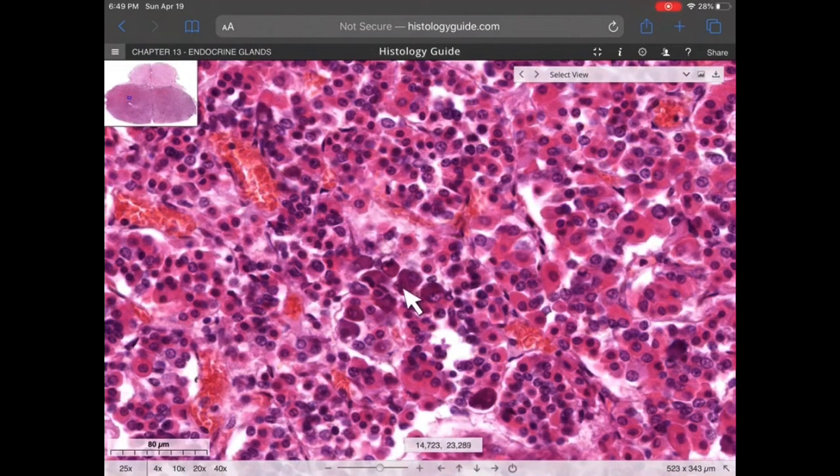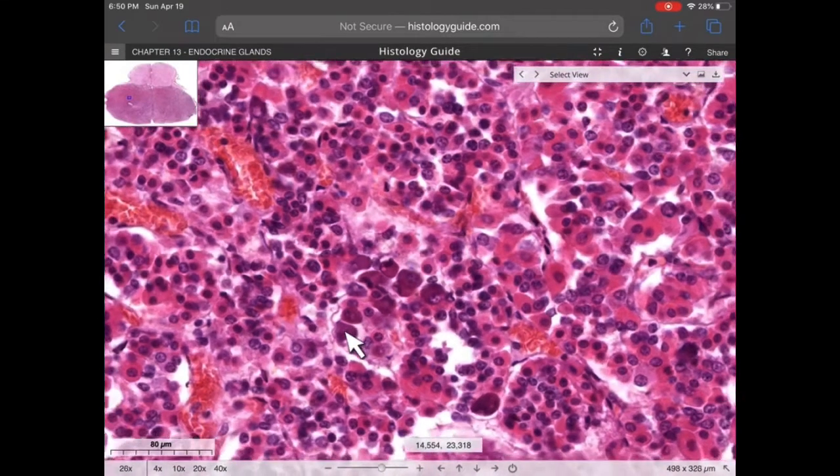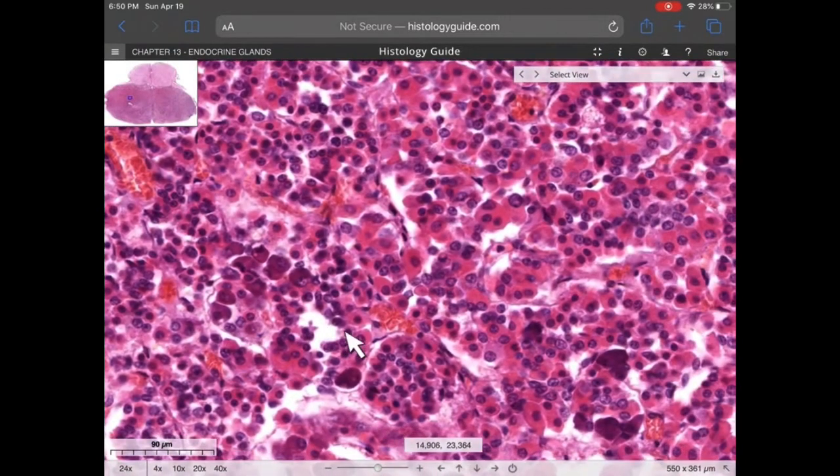So the reason that the pars distalis looks so much more vibrant compared with the pars intermedia or pars nervosa is primarily because of what kinds of cells are there. So these really darkly staining ones are basophils. They like to stain dark and purplish in a hematoxylin and eosin stain. There are also acidophils, which are these really, really bright pinkish orange guys.